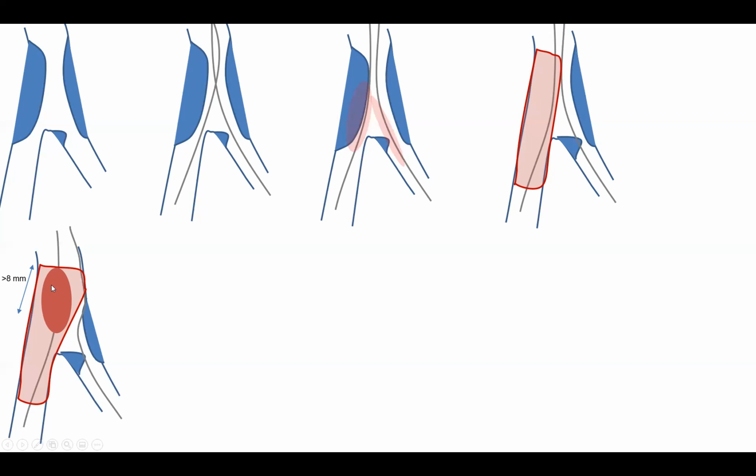So you dilate that proximal main branch with a larger balloon. The important thing is that the balloon should be large. It doesn't have to be high pressure, although you can go high pressure. But the most important thing is that it should be large, usually about 0.5 to 1 millimeter larger, and I'll explain how to size it.